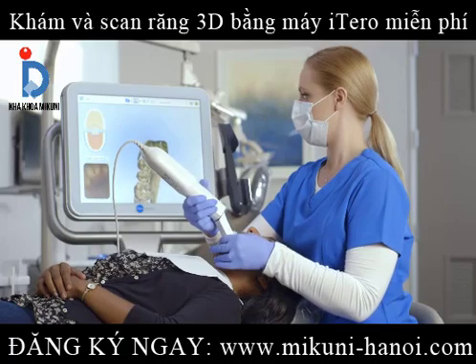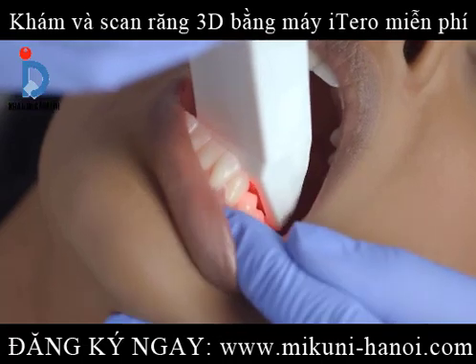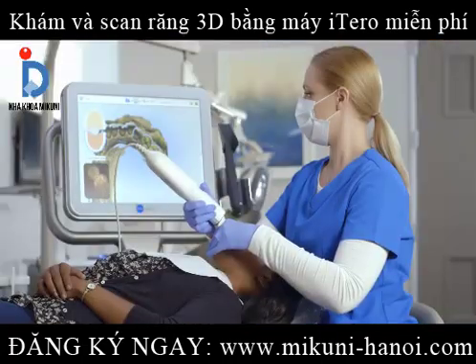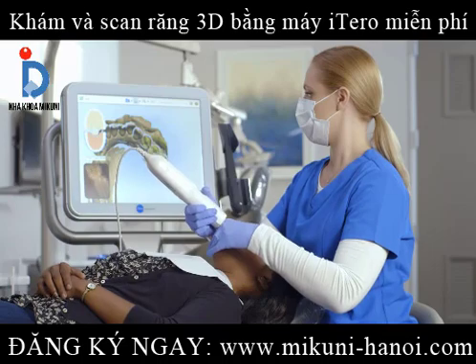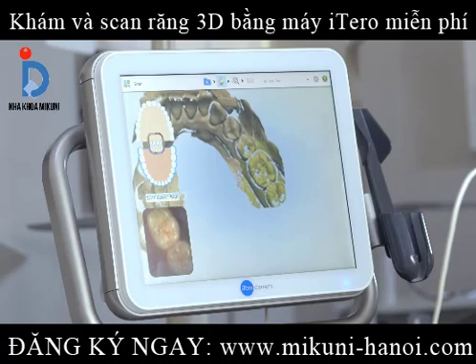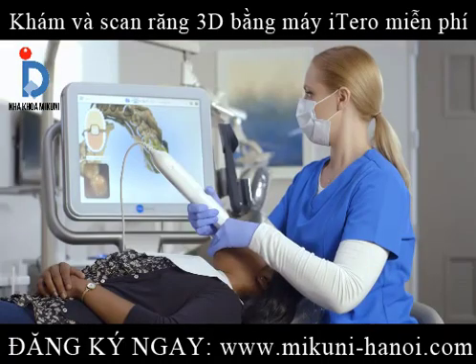Starting on the occlusal of the arch, being sure to keep the wand flat on the occlusal, I'll steadily bring the wand towards the anterior. When I reach the bicuspid, I'll simply continue by swiping across the anterior, tilting slightly to the lingual at the contralateral bicuspid, and then proceed by moving the tip straight back to the opposing terminal molar.